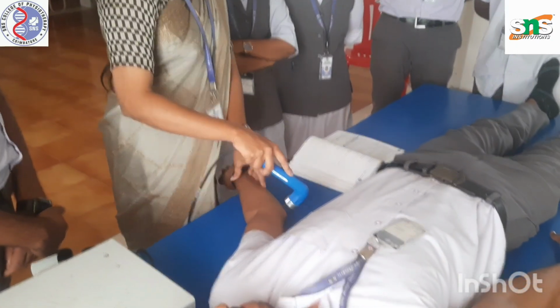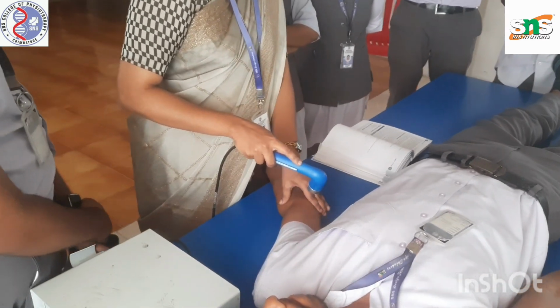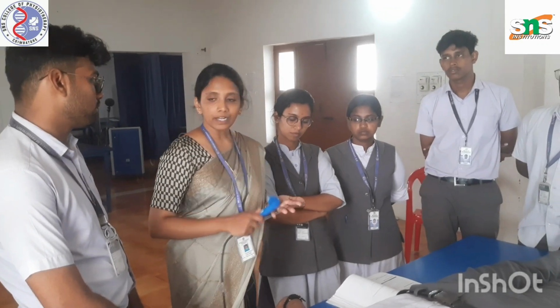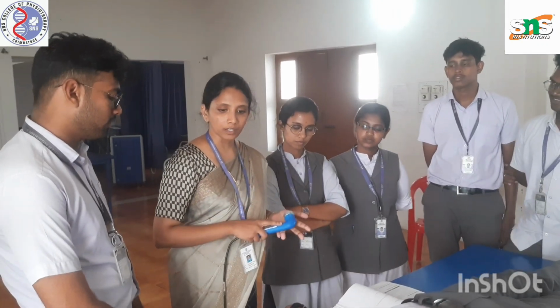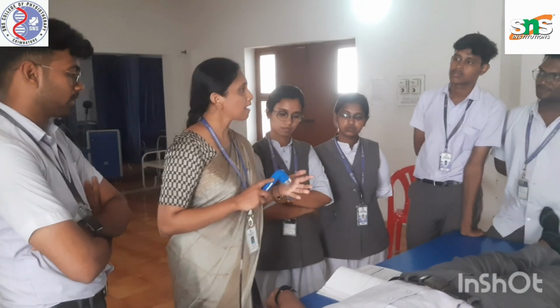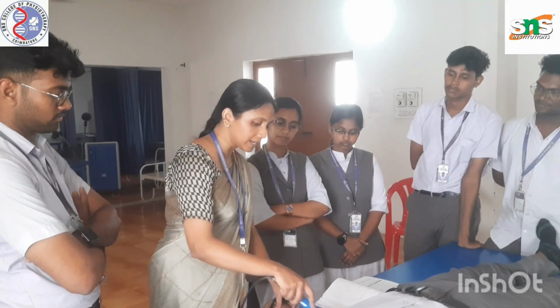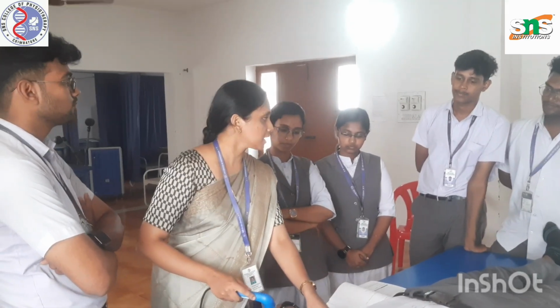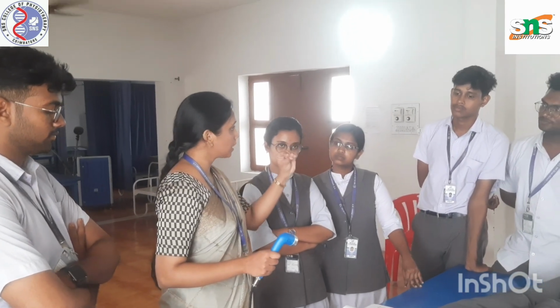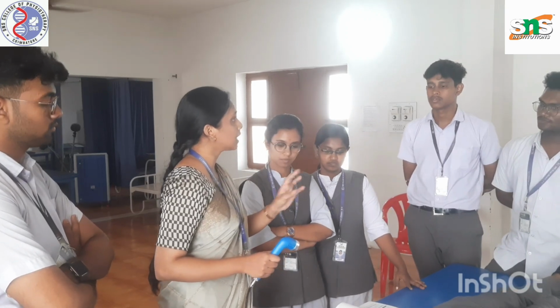This ultrasound wave is directly transferred inside the tissue. So what are the physiological effects we can expect? Heating effect and non-heating effect. In the non-heating effect we can expect cavitation. The tissues inside the treatment area will be having a cavitation. Cavitation is the upward and downward movement of the tissues which causes vibration inside the tissue.